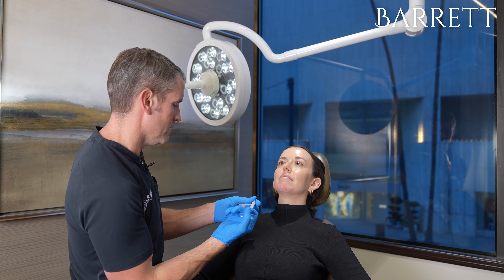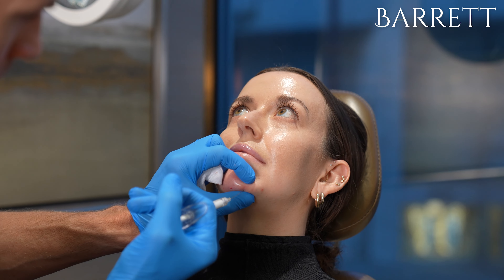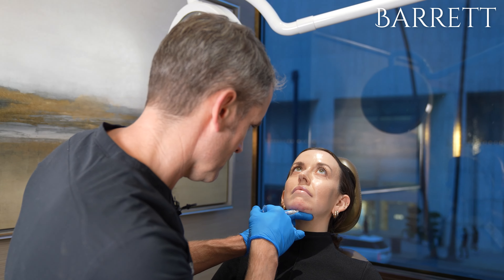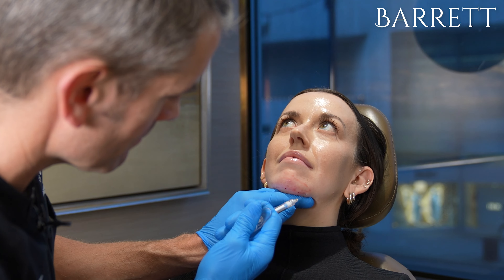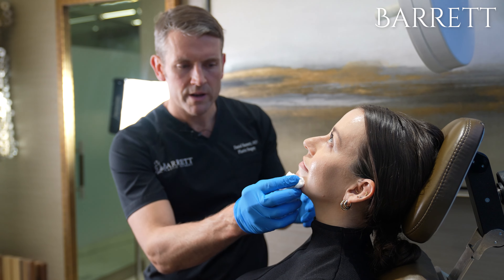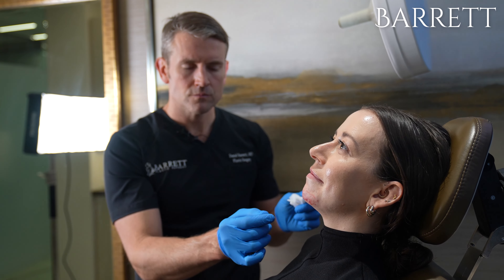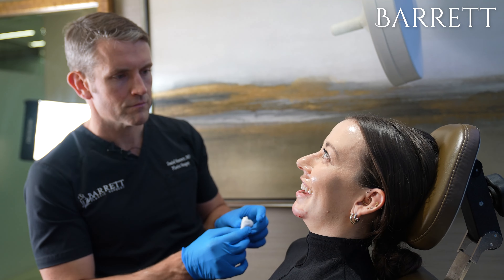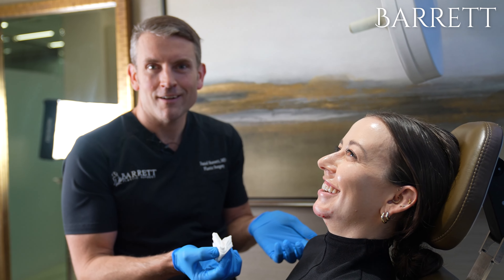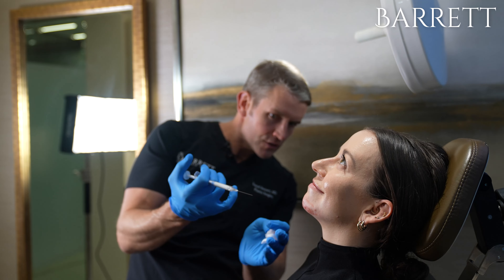We're going to go ahead and get started. All right, so we're about halfway there. How are you feeling? Totally fine — I'm not feeling anything at all. You have a steady surgeon! Now we're going to go for round two. I'm going to go for more anterior projection now.